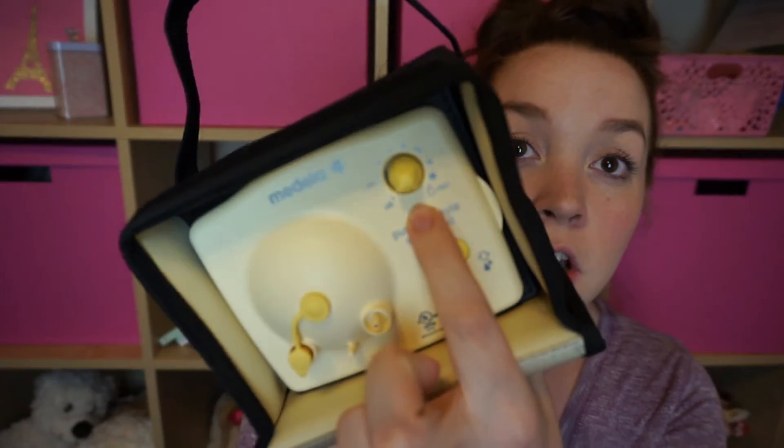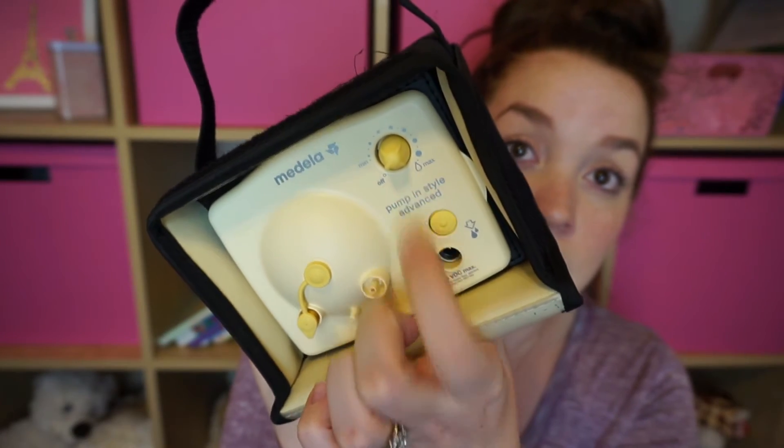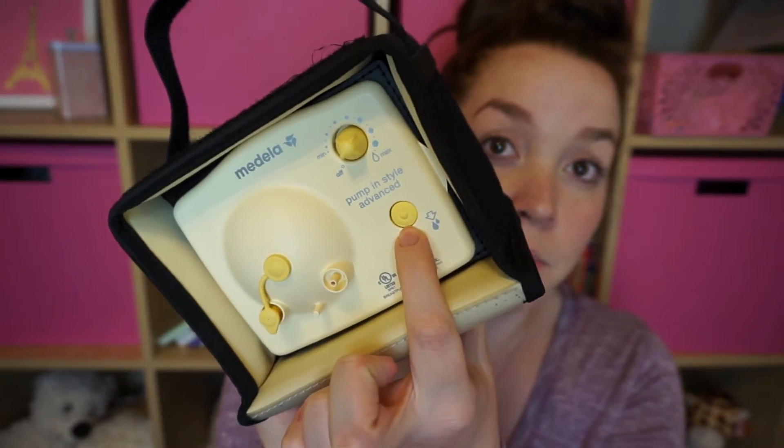As for function and ease of use, this pump is super straightforward. It has a dial to increase the suction strength and frequency, and a letdown button — that's really all you need to use this pump. As for recommendations online, it got really great reviews; I didn't find anything lower than 4.7 stars out of 5. However, word of mouth, I feel like it gets about 50-50 reviews.